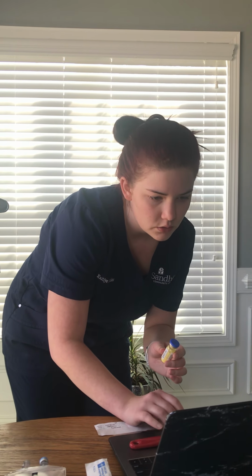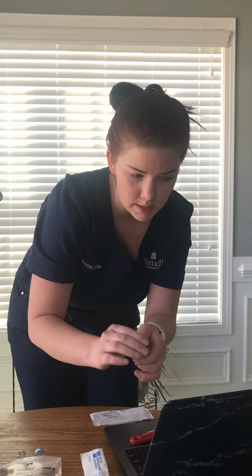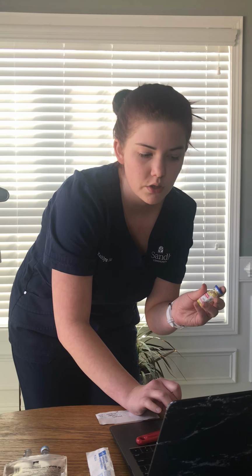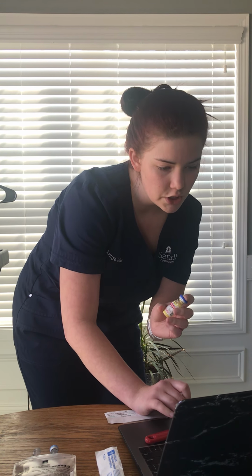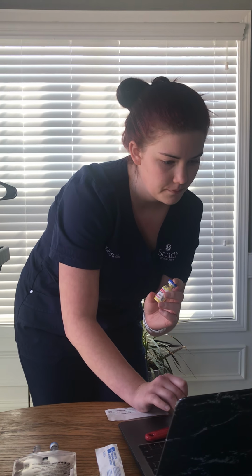Now I'm going to check for the name again, cefazolin, and the expiration date, and it is within the expiration date, so we're good. I have confirmed the patient, the drug, the dose, the route, which is IVPB, the time, which is now, and no allergies, so we're good there, and the birthday.